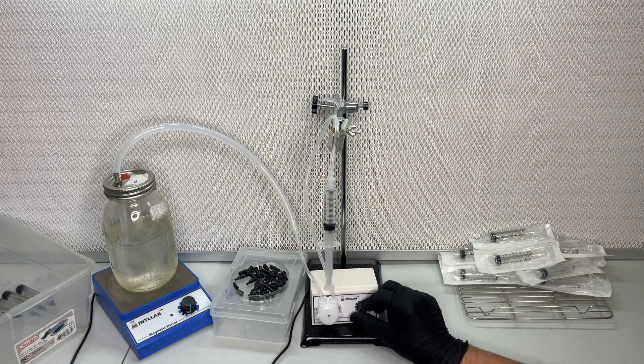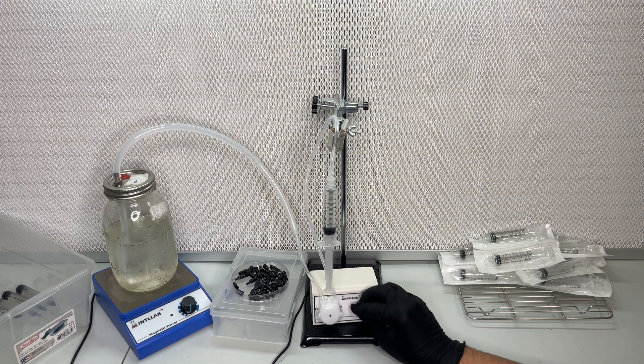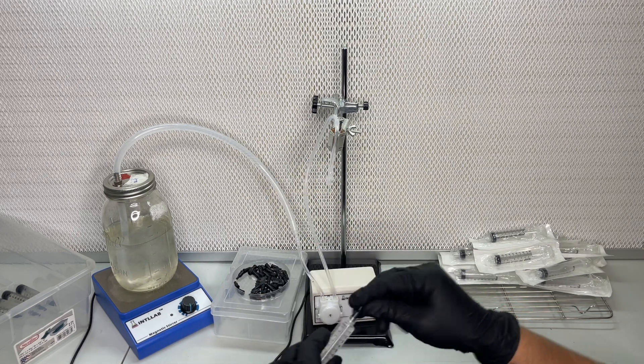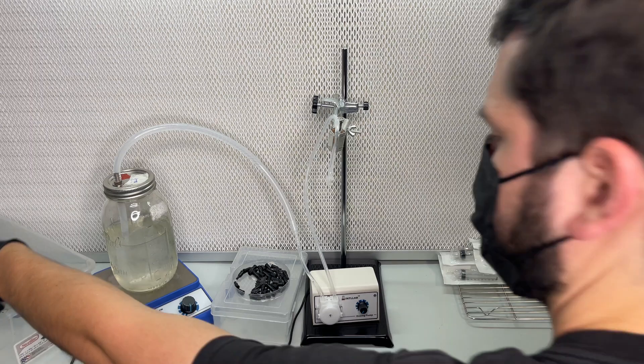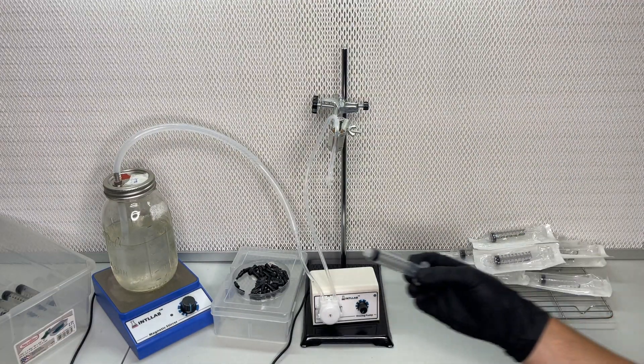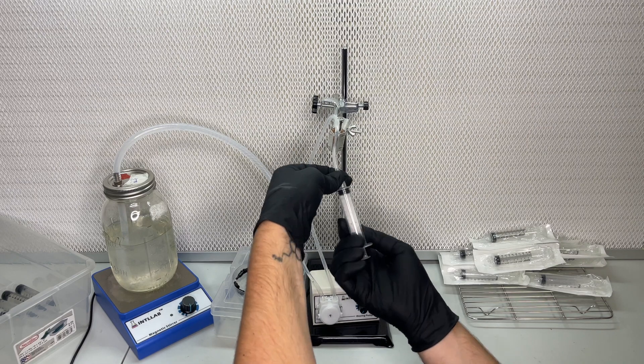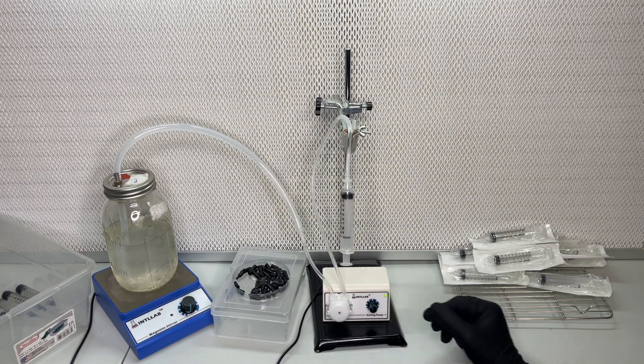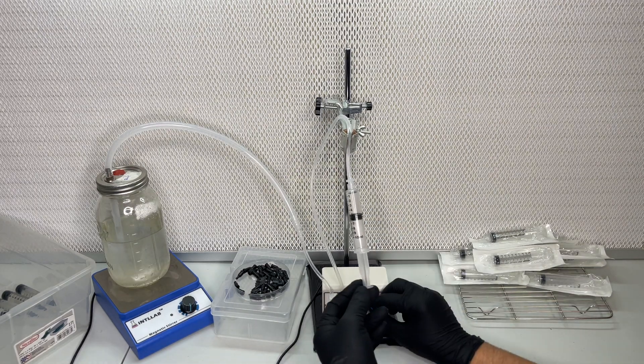Some things I would do to improve the system would be to add a foot pedal and also maybe a better peristaltic pump that fits a quarter inch tube.